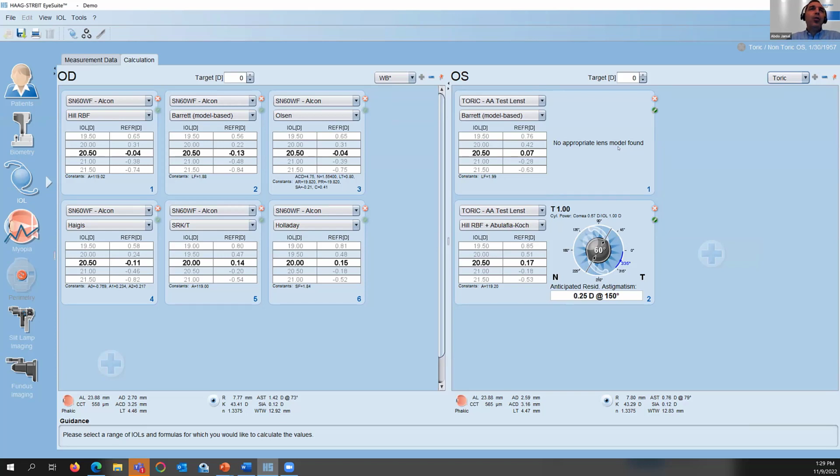So what could be a solution to make sure that our suggested plan is correct?